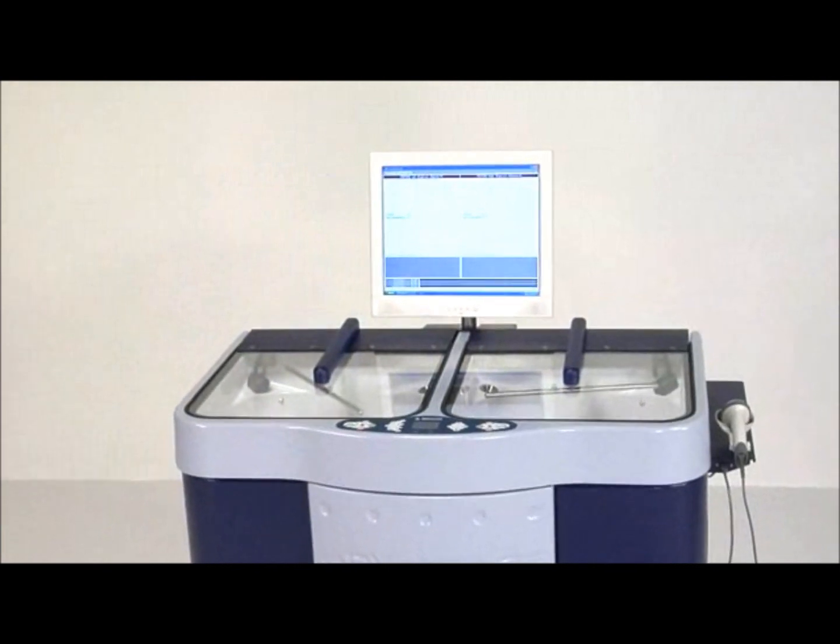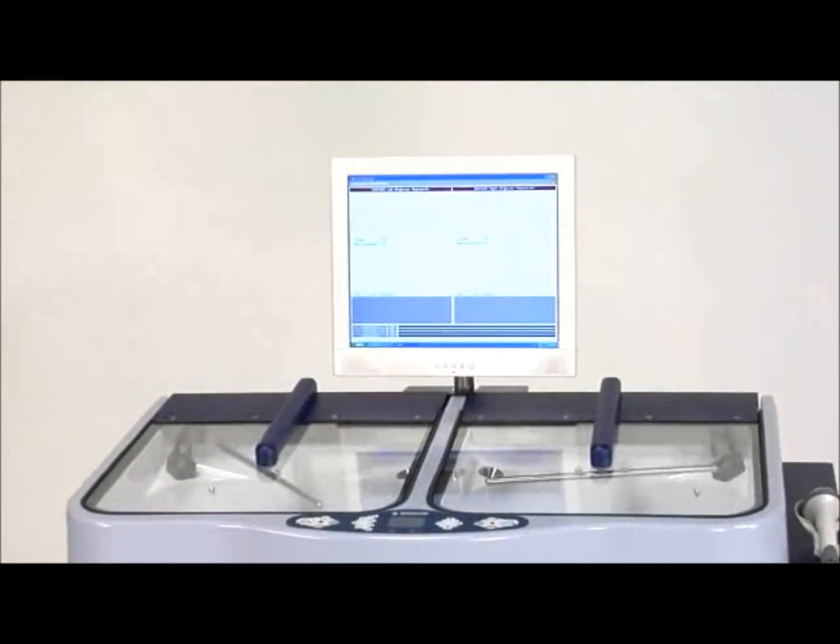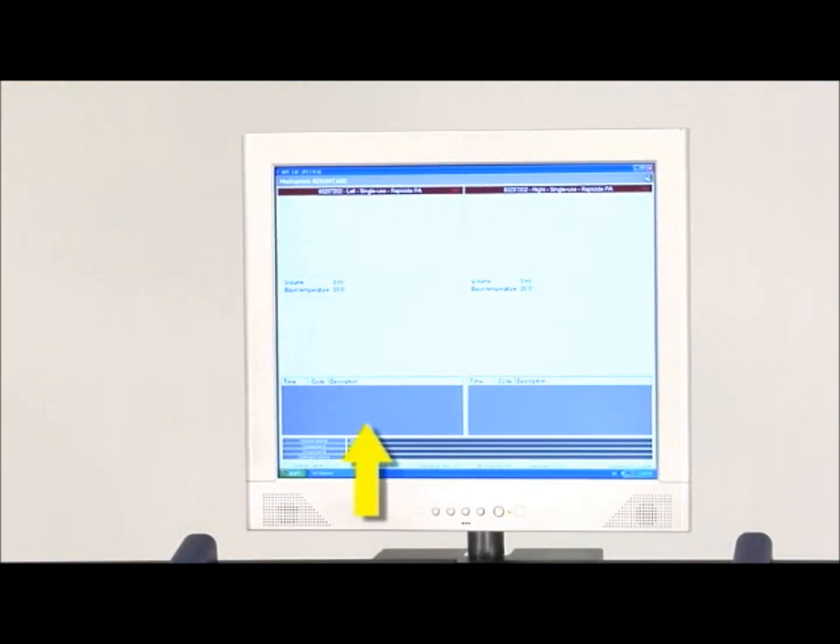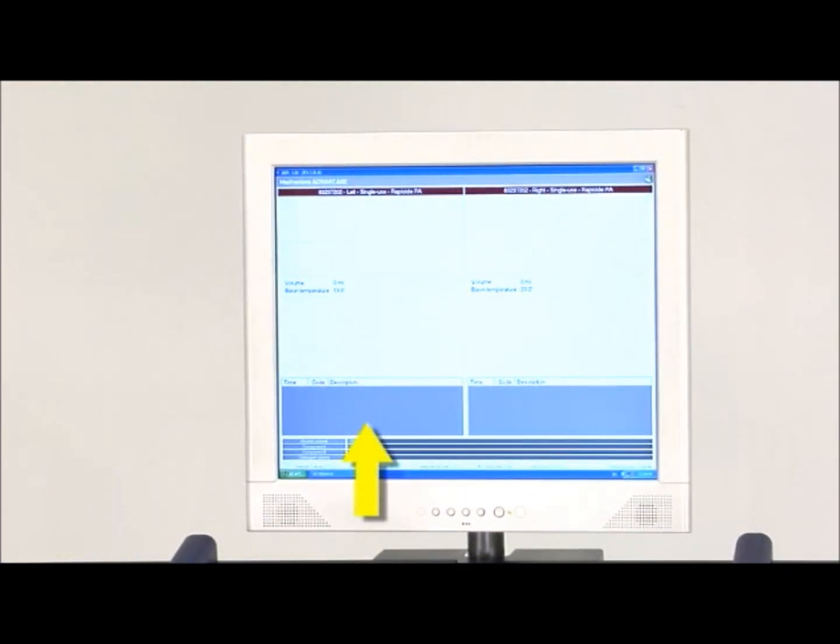The monitor displays in a split-screen format for easy viewing of each basin's cycle information. For example, the left side of the screen displays the cycle information being performed in the left basin.